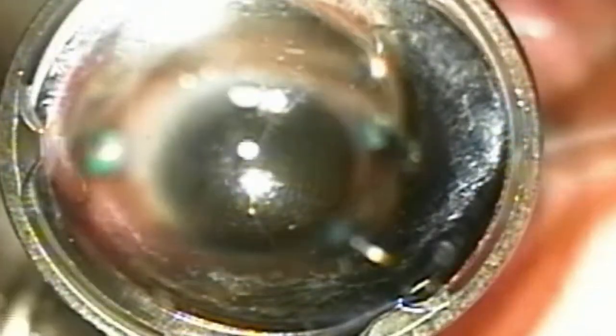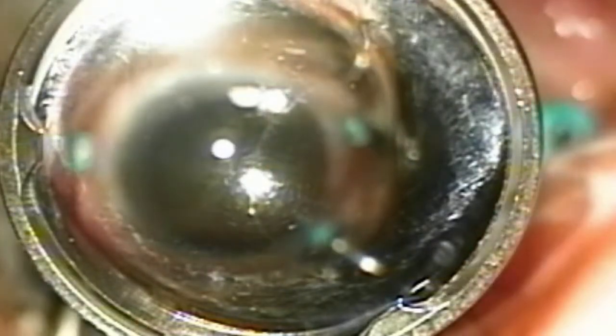This is a standard three-port system, and now we're putting in the lens that gives us a nice wide-angle view. To the left is a light pipe, to the right is the vitreous cutter, and all the red material that you see floating around is blood in the vitreous.